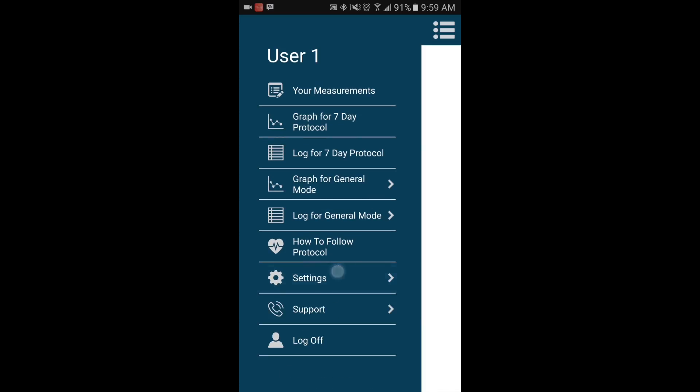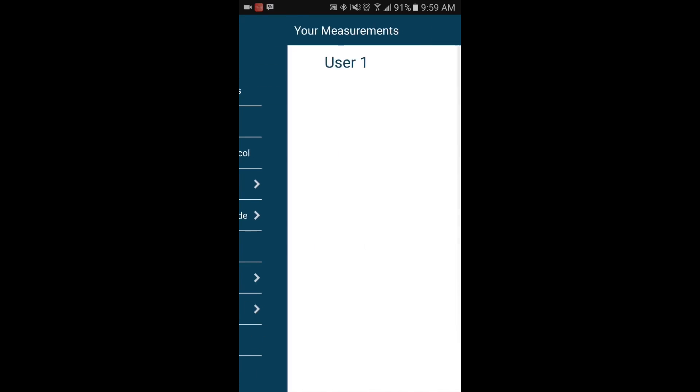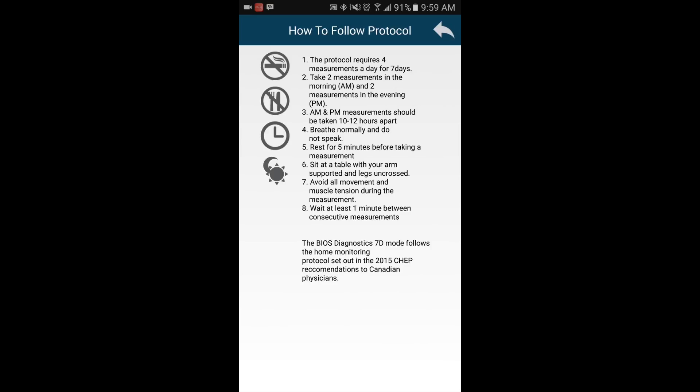Let's select How to Follow Protocol. A new screen will open.